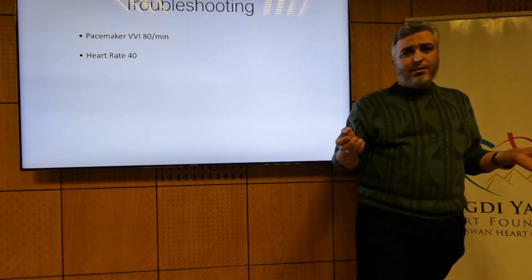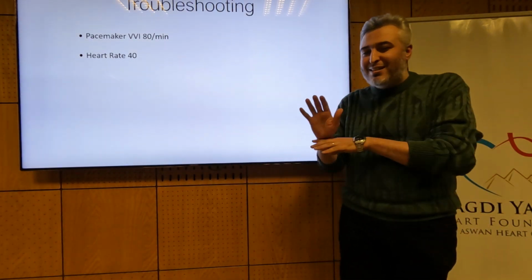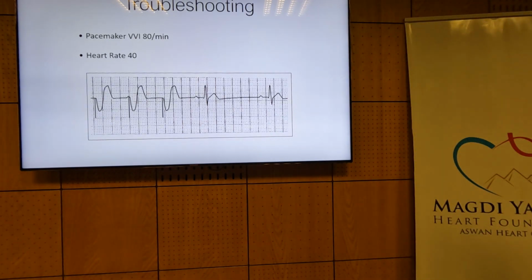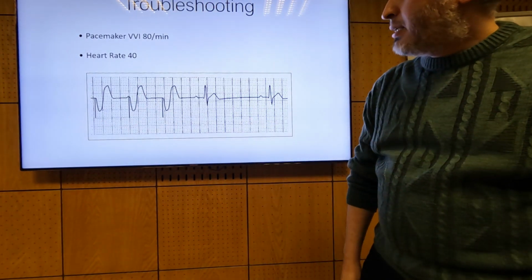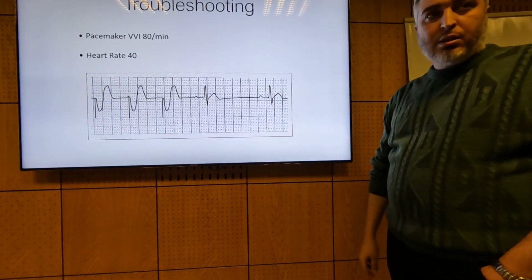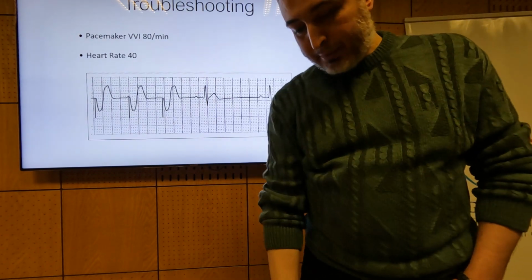All sorts of mechanical things. The pacemaker lead is not well fixed on the ventricle. The pacing lead is defective. The battery is actually getting consumed. So all sorts of other things. Okay. So this is being paced, and now here is slow rate with no spikes. So again, there are no spikes at all. So it's either oversensing or the mechanical factors. Okay.